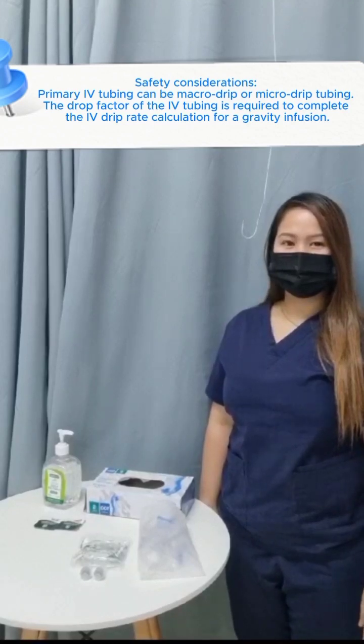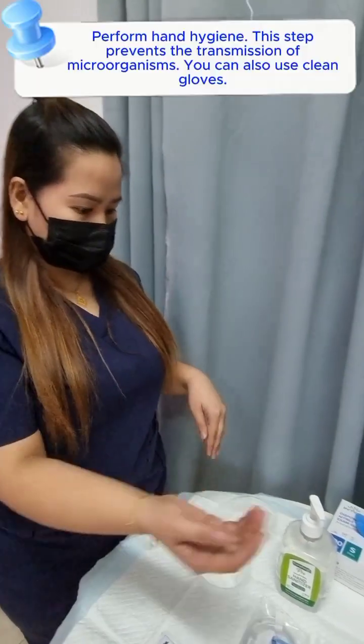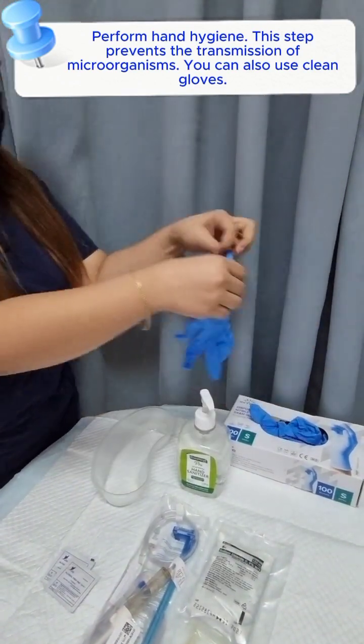Safety considerations. Primary IV tubing can be macro drip or micro drip tubing. The drop factor of the IV tubing is required to complete the IV drip rate calculation. For a gravity infusion, remember to invert all access ports and back check valve while fluid is running past that location. Perform hand hygiene — this step prevents the transmission of microorganisms. You can also use clean gloves.